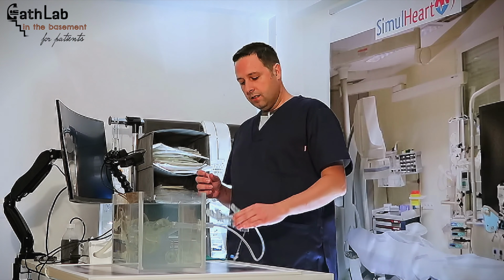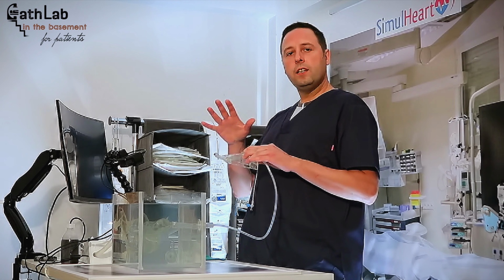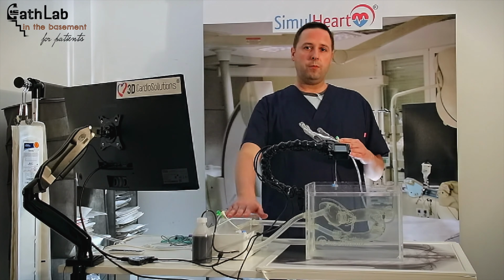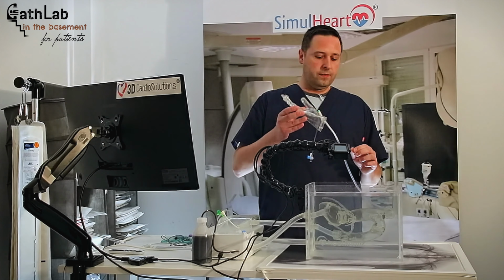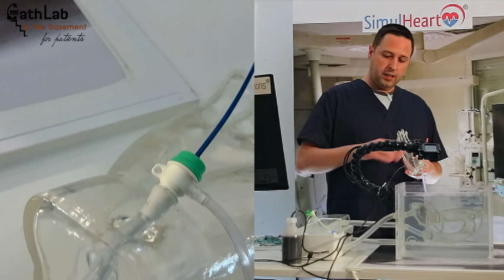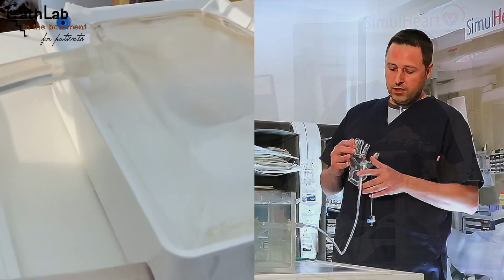In this case, we are going to use the radial access, and we can discuss the advantages of radial access versus femoral access. As you can see, the arteries here are thinner than here, and so these arteries are much more compressible.